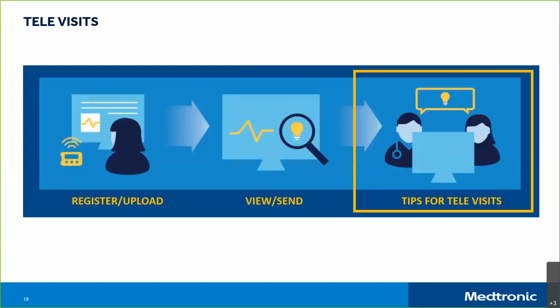Well, to start, uploading your pump prior to the televisit is a great start. By having your pump information already uploaded and accessible by your healthcare provider, you are already providing a lot of information about how you are doing and how your pump is working. This will generate a lot of discussion, like your glucose trends and any adjustments needed within the settings and ratios. Make sure that you write down any other questions you might want to ask your provider. For example, if you're experiencing a lot of highs or lows at specific times of the day, make a note of this so you can discuss it with your provider.